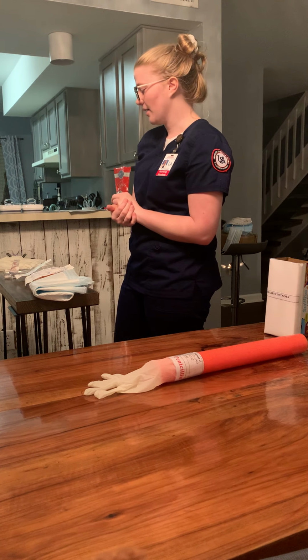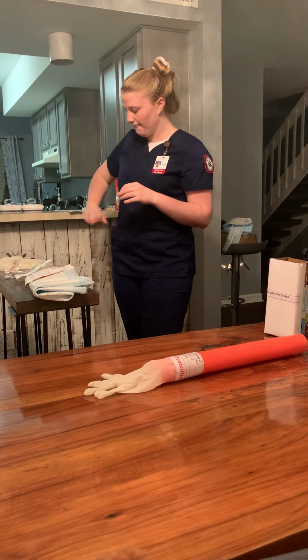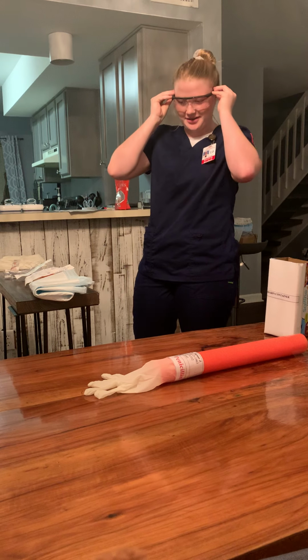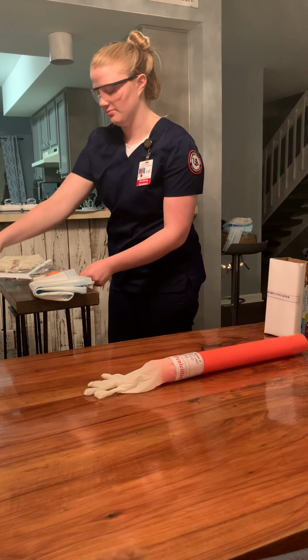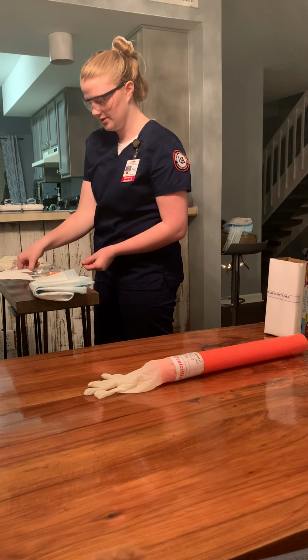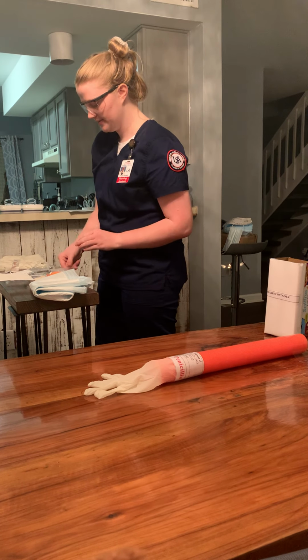So now I'm going to remove my glasses and apply my goggles. And I'm just going to organize and open my materials here on my bedside table, making sure to maintain sterile technique.